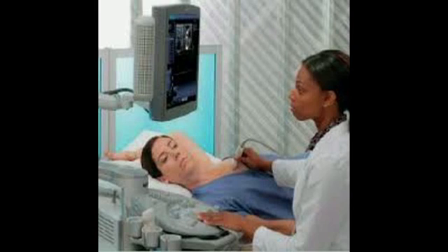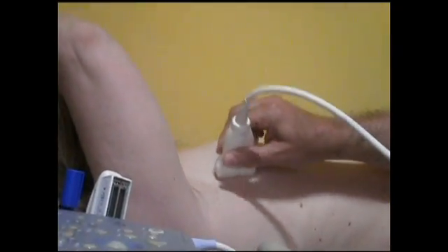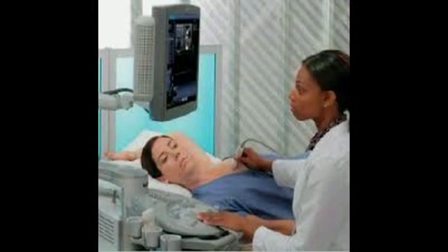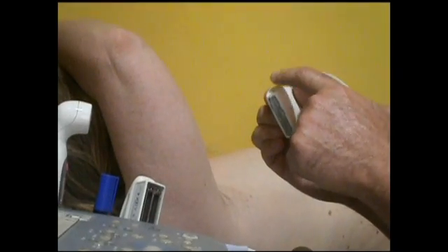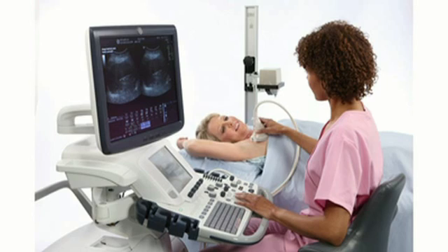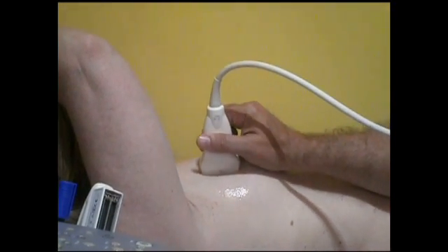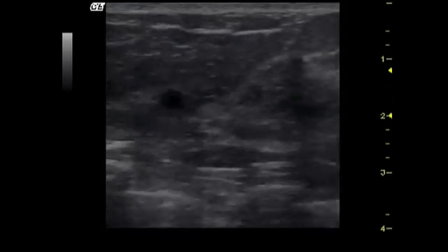The examiner is sitting at the height of the patient with the patient as close to the edge of the bed as possible, bringing her body close to the examiner. This setting will help us to have a better grip of the transducer. The probe is gripped with all fingers at the base, resting the examiner's forearm at the patient's torso. Remember to orientate the probe in the right direction relative to the head of the woman in order to avoid confusion. The transducer is moved by flexing the wrist only in order to follow the convex of the breast.